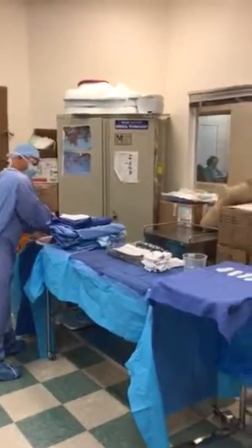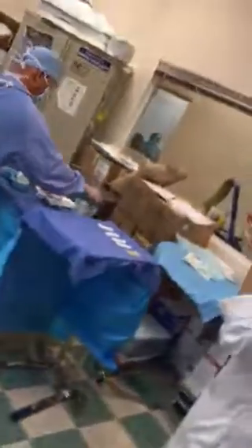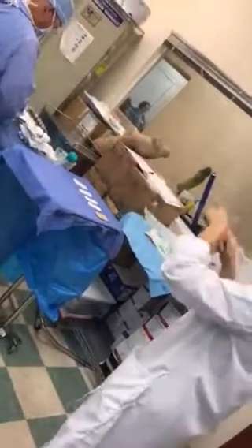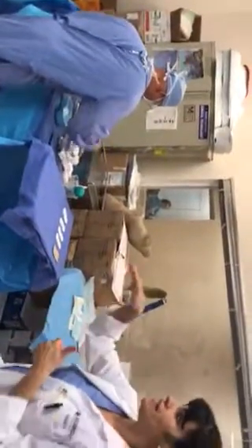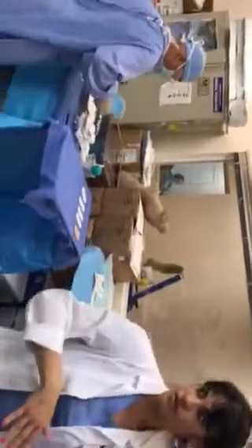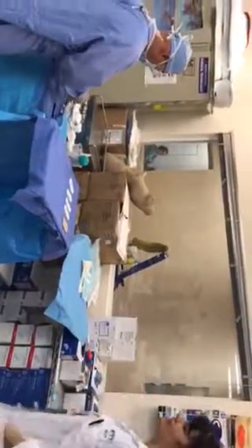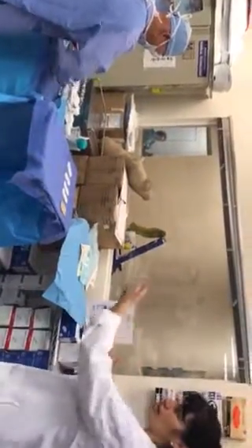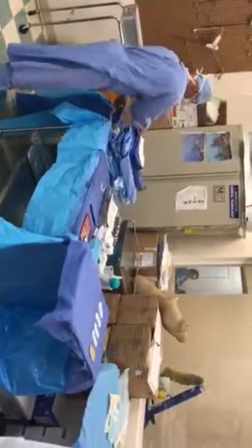A key thing to remember: always place your basins where the feet of the patient are. Sometimes it's difficult — there are rooms where the patient comes in and your back table is positioned differently, so you don't know right away whether to set up to the right or left. Usually in this kind of setup you set your basins to the feet of the patient, because that's how you'll bring in your back table.